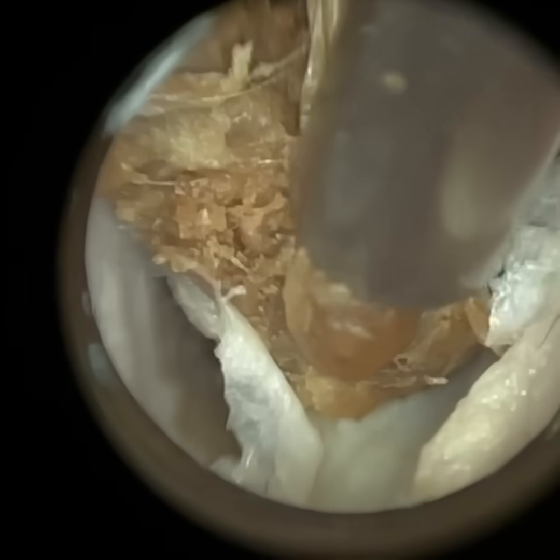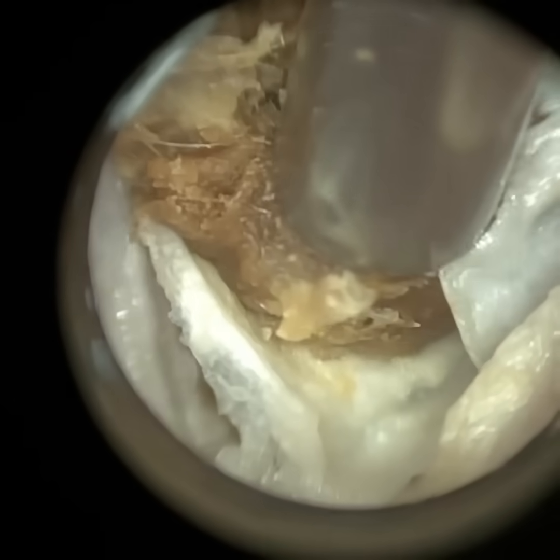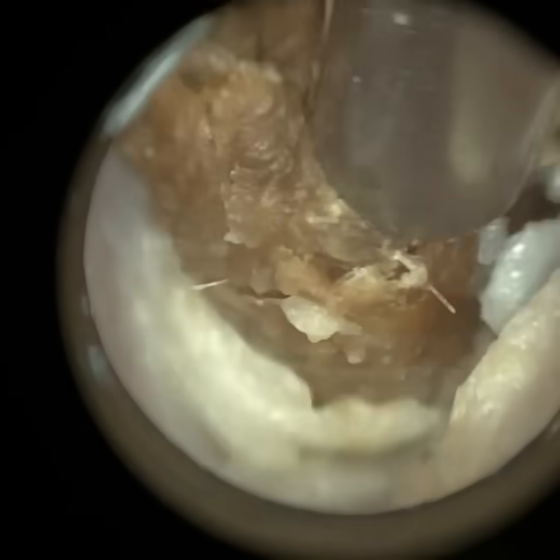They had been getting water inside the ear and subsequently developed otitis externa. They've got really dry skin plugs, but on the periphery some of the skin — the more silvery matrix — has become a bit damp as a result. We've cleared this debris and obviously written to the patient's GP for some treatment.